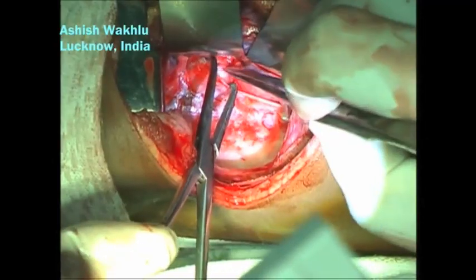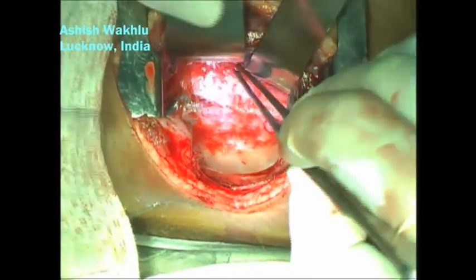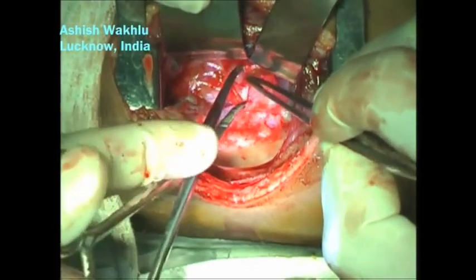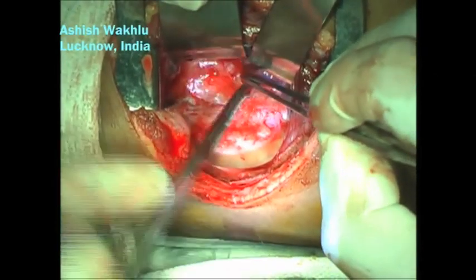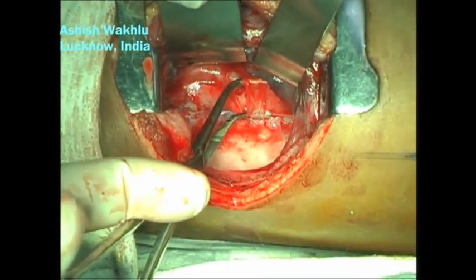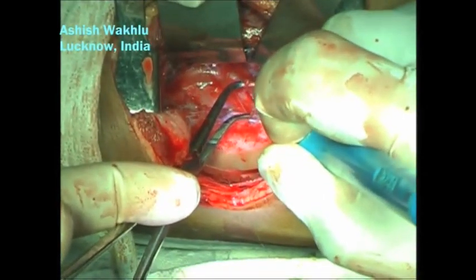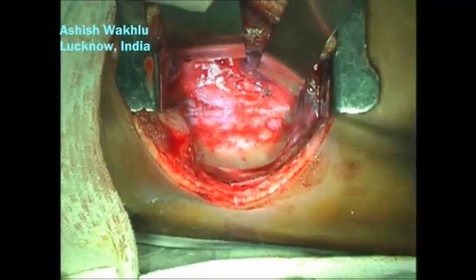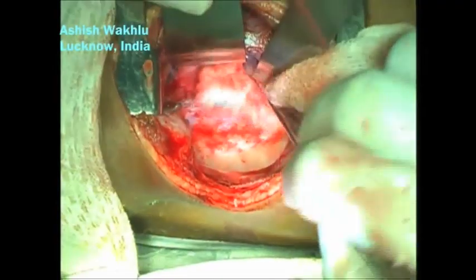And after opening this, we should be able to see the bifurcation of the trachea and the stump of the right main bronchus. So that is the mediastinal pleura being divided, carefully held up in the jaws of the Rumel's artery forceps.